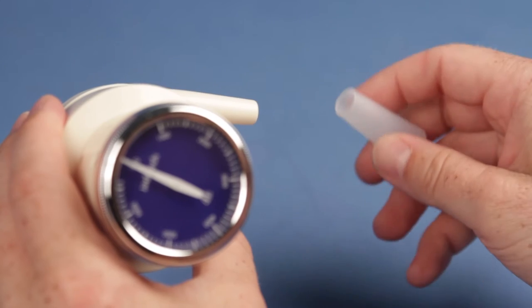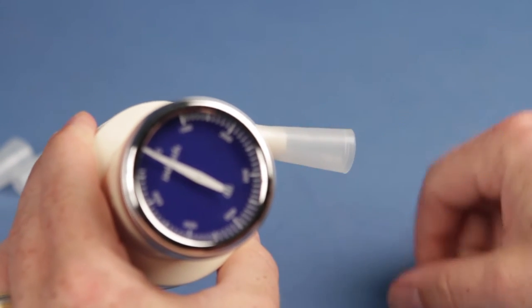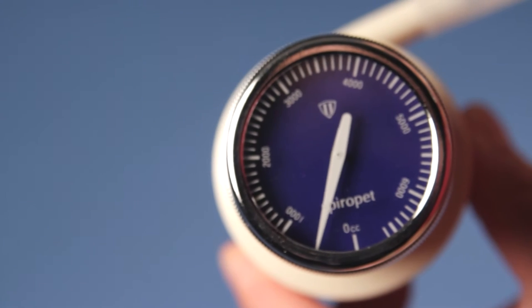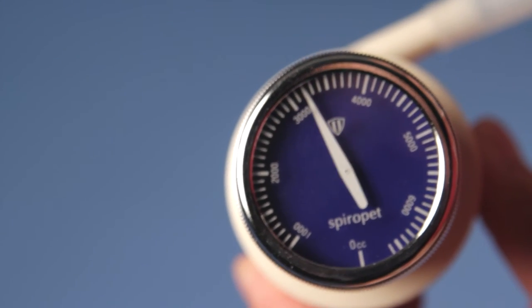The Dry Spirometer from Carolina is compact, portable, and comes ready to use. The direct read dial is calibrated to 7 liters and can easily and accurately measure vital capacity, tidal volume, and expiratory reserve volume.